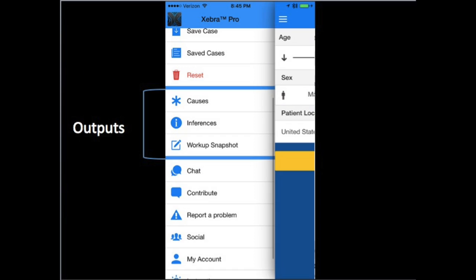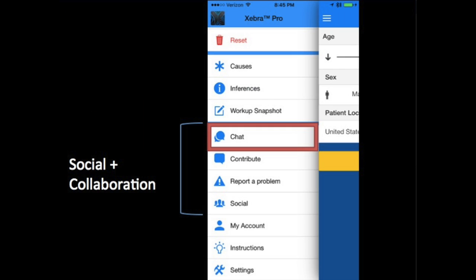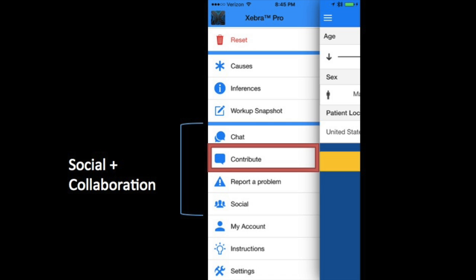In the center we have the outputs: potential causes, inferences and workup. And at the bottom we have the social and collaboration items, chat and share documents with colleagues around the world. Contribute and improve medicine for everyone.